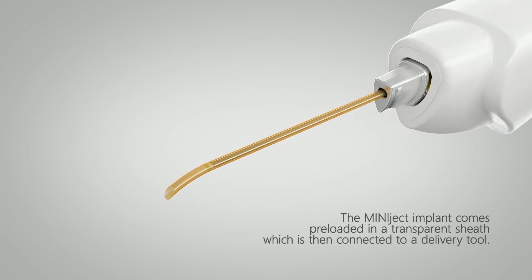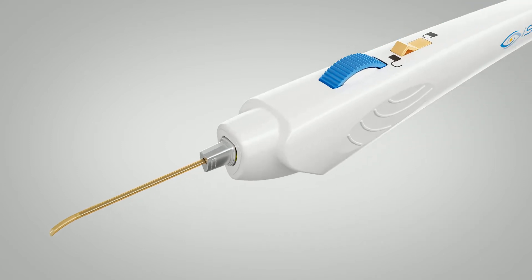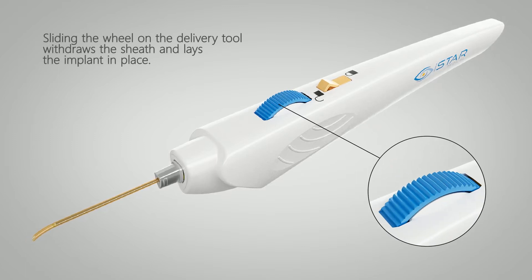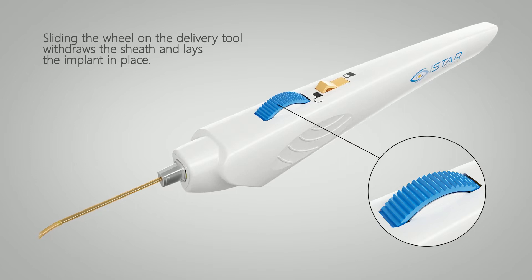The Miniject implant comes preloaded in a transparent sheath, which is then connected to a delivery tool. A lock on the delivery tool prevents premature release of the implant. Sliding the wheel on the delivery tool withdraws the sheath and lays the implant in place.